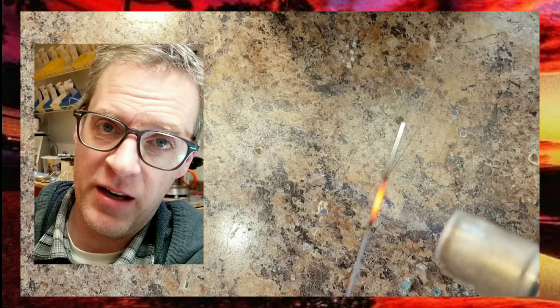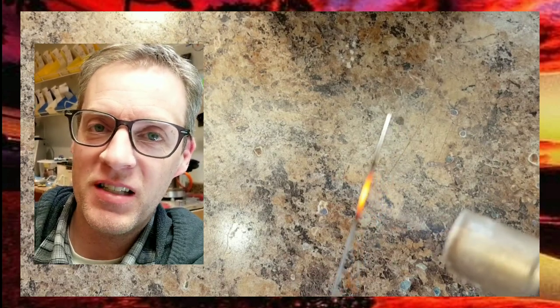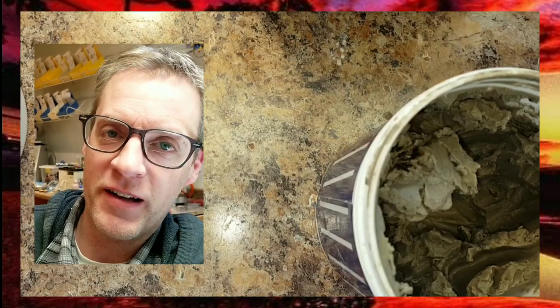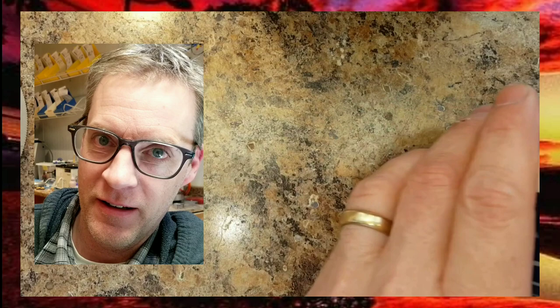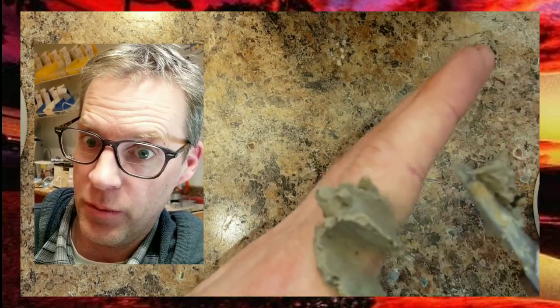Everybody, Steve Zart here from Zara Dental Lab. In this lab video, do not try this at home. Do not try this in your lab. I'm just using this as an example to show you how a heat shield will protect anything. Warning, this is stupid.